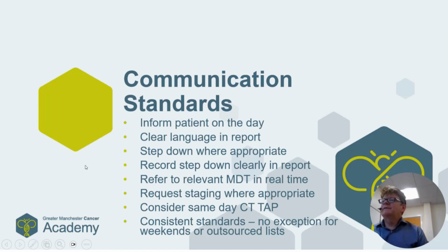Finally, in respect of communication standards, I think it's possibly the most important slide. Where we see a cancer, we must inform the patient on the day, use clear language in the report and in our communications with patients. If we see a cancer, we've got to use the word cancer when we are describing that. Step down where appropriate, and record that step down clearly in the report also, and explain that to the patient too. Refer to the relevant MDT in real time.